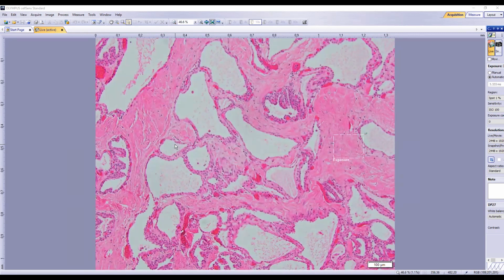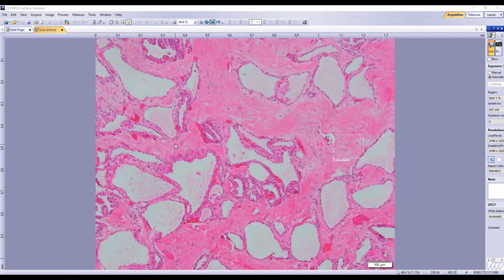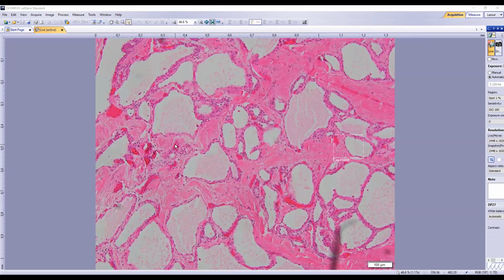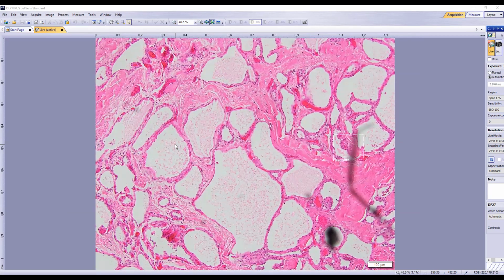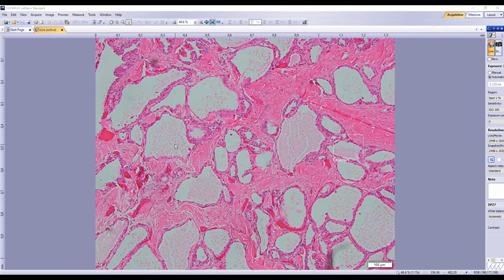Anything between 0.1 to 1 centimeter is microcystic. And then if it's solid, truly, then it's a solid serous cystadenoma, which is very rare. So this is microcystic serous cystadenoma, and grossly, boards can test you and give an image of the cyst, which has a spongy appearance, a well circumscribed cyst that has a central stellate scar, and that's your clue for serous cystadenoma.